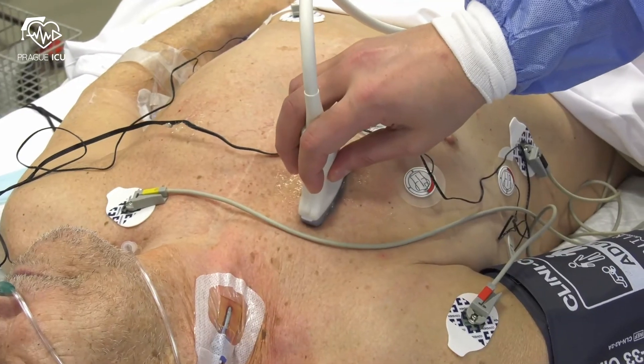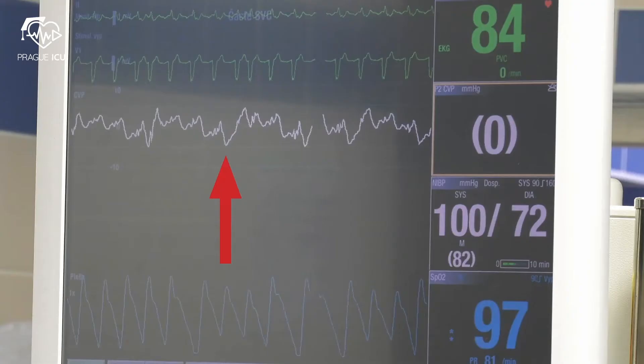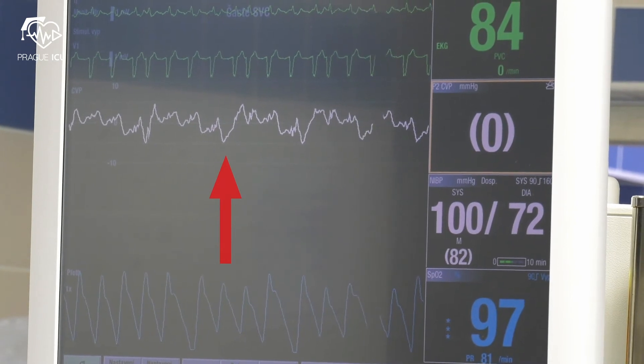At the end of the procedure, use ultrasound to check pleural sliding and other signs to exclude new pneumothorax. Attach the central line to a pressure bag to allow CVP monitoring.